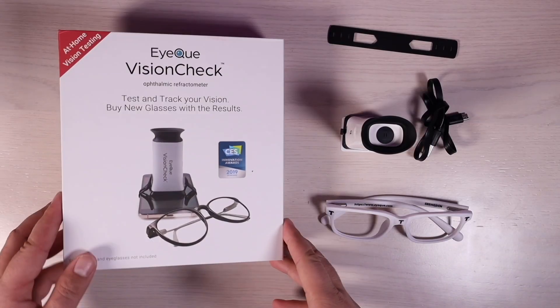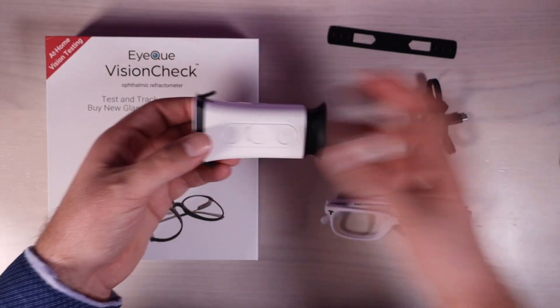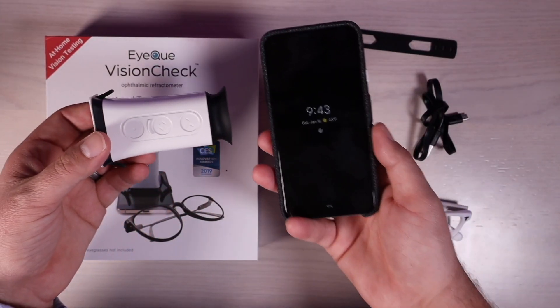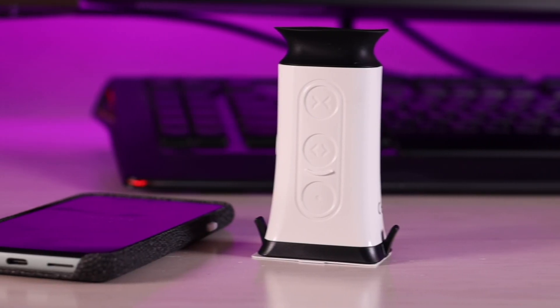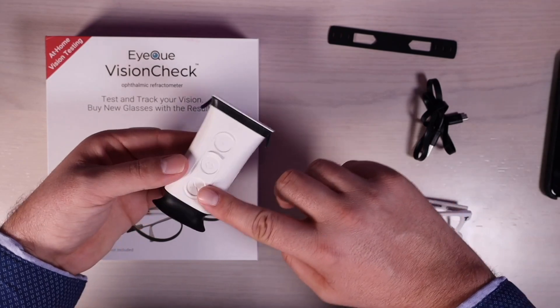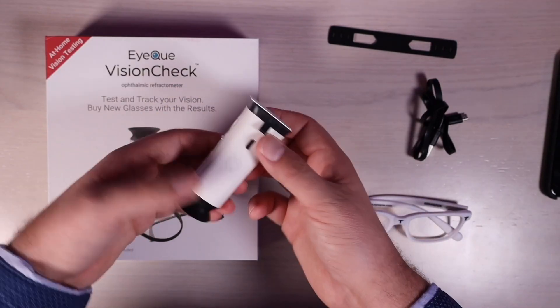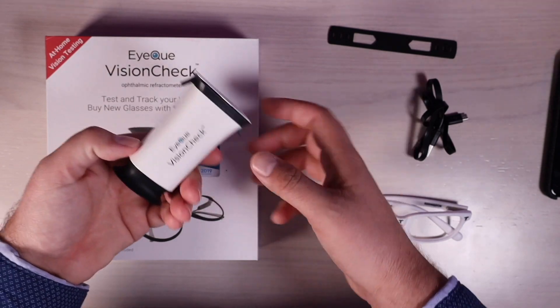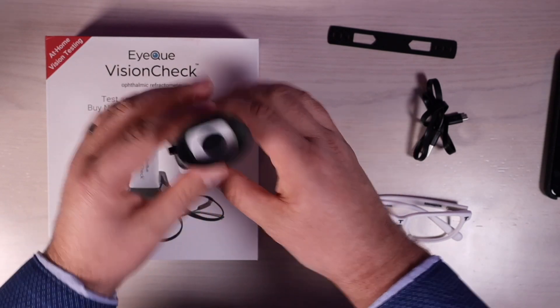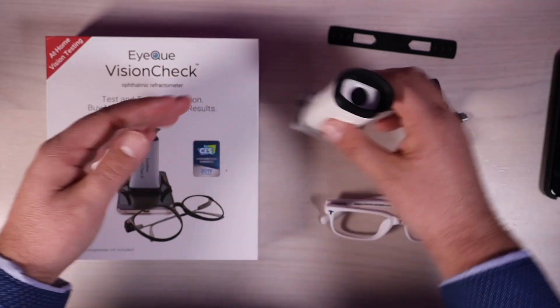Let's take a look at what all comes in the box. This is the vision check device — this is what you're going to connect to your smartphone to actually do the vision check test. As you can see, you've got a couple of buttons here that you'll use to line up the lines. This button here is going to be to select. You've got your power button and a charge port, and then this is where you'll rest your eye and look in for the actual test.